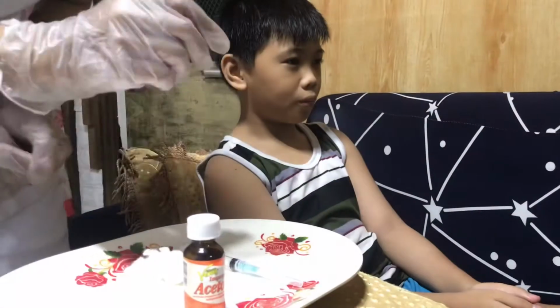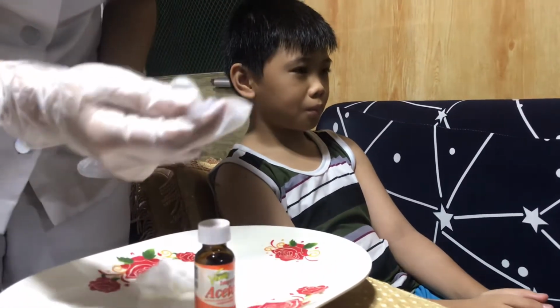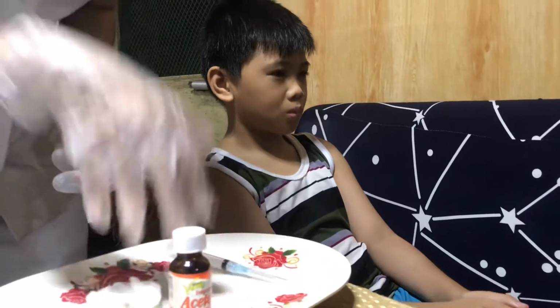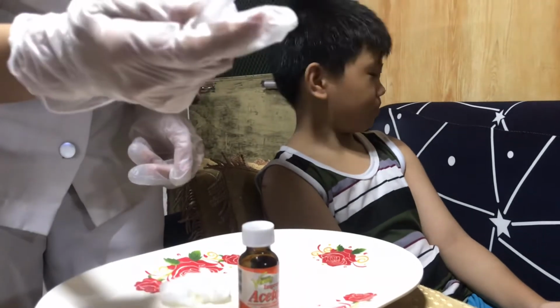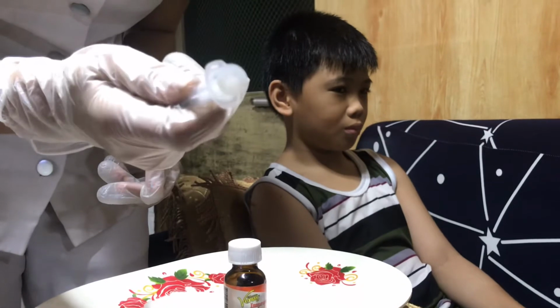And remove the needle cap by pulling it straight off. Hold the syringe between the thumb and the forefinger of your dominant hand as if you are holding a dart. So this is my dominant hand, and this will be the position in order for you to remove the cap.